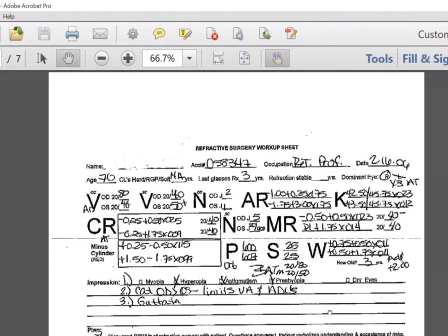This helps the practitioner to think about whether to do some repeat measurements. If the keratometry measurements are very different for the instruments being used, they may choose to repeat the measurements, right? Because they may not be certain which ones are more accurate.